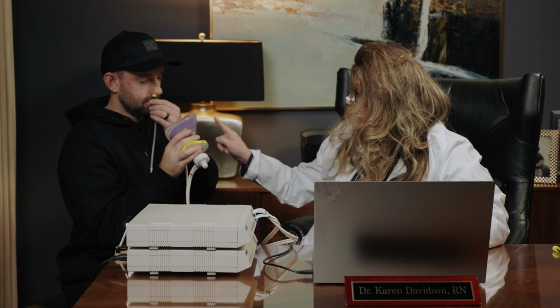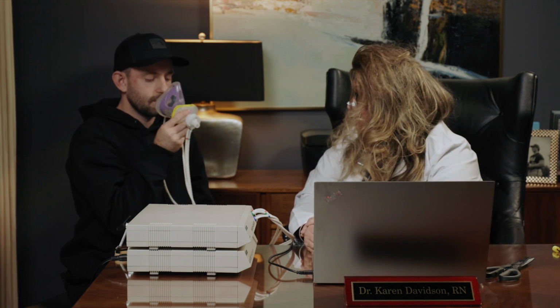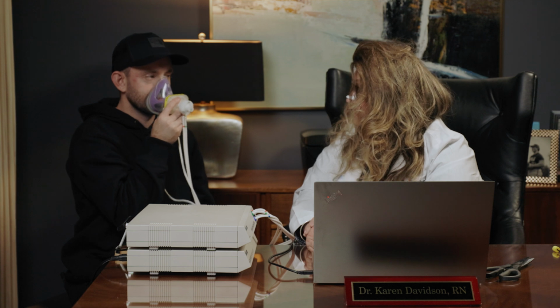We're going to move the foam over to the left nostril. And it is not uncommon to have one nostril larger than another. And we see this often with a deviated septum or a nasal valve problem. Now we're going to capture the flow on the right side and measure it against a pressure gradient to create resistance and see how much is built up in the nose. And there's already natural pressures in the nose. Okay, mask up, sit up, and let's go. Again, we're waiting for the measurement of the nasal resistance to pop up.